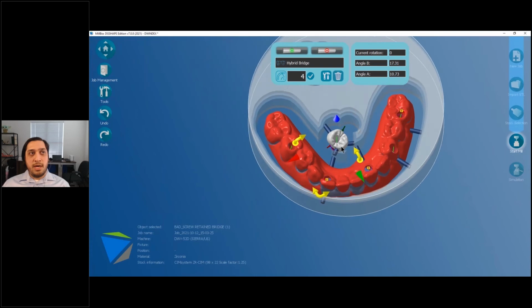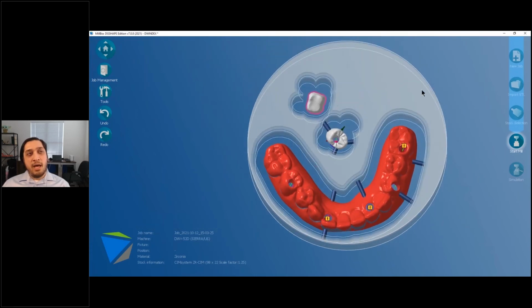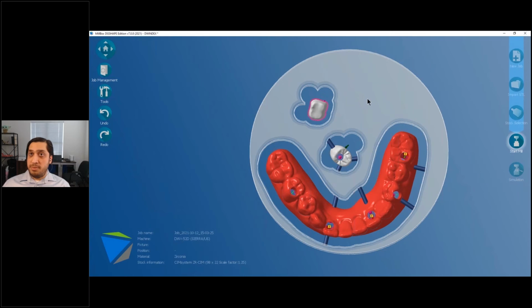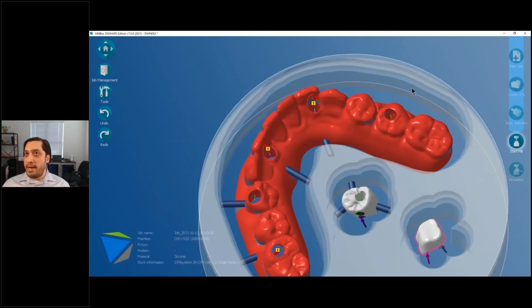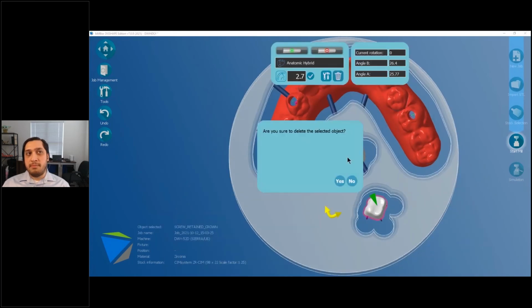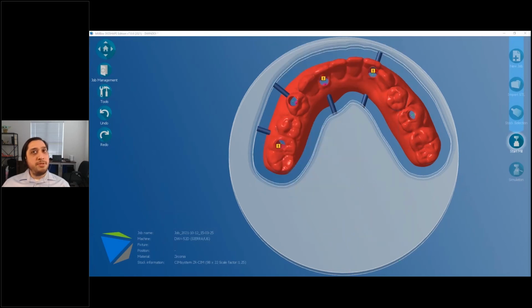So there's always a couple different ways, let's say, to skin a cat. There's always different methods you can go about things. So this is just one of those additional flexible tools that we've implemented that really kind of help drive home the capability of the CAM to really mill anything that you want to throw at it. So that's where we've kind of increased our flexibility and focus, particularly on the MillBox development side over the past couple of years. So we've covered 2 of our talking points.